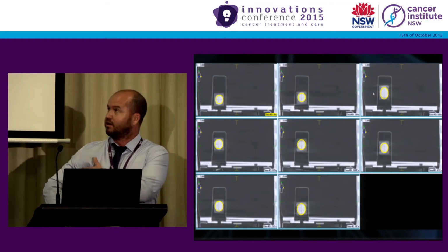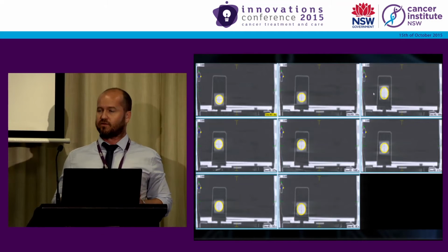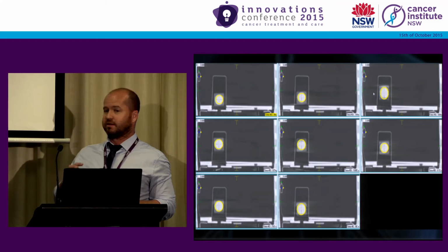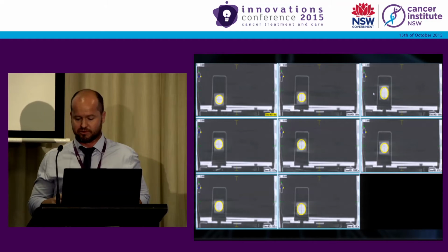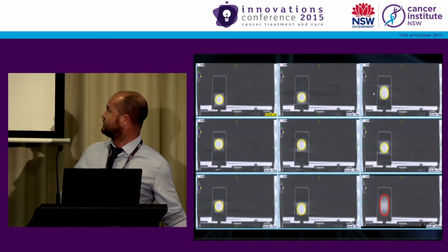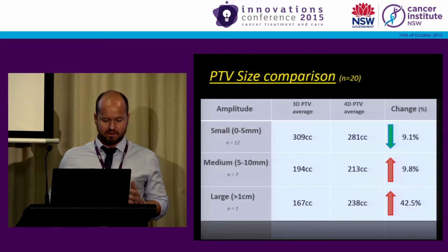So going back to our phantom example, what we have here is a complete series of data from the one scan, showing the different phases, showing different 3D reconstructions that correlate to different parts of the respiratory cycle. So practically speaking, if you take a composite view of sorts, you can come up with a far more appropriate target that's specific for that patient. So there's kind of a 2-way benefit going on here.